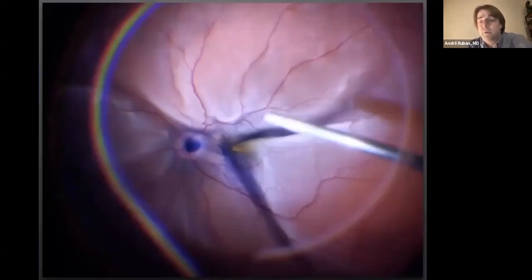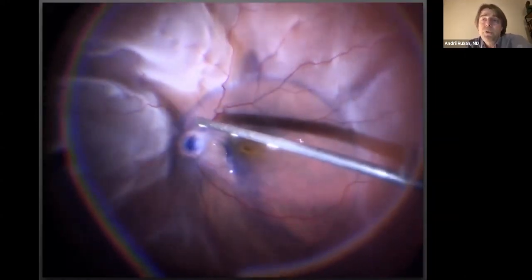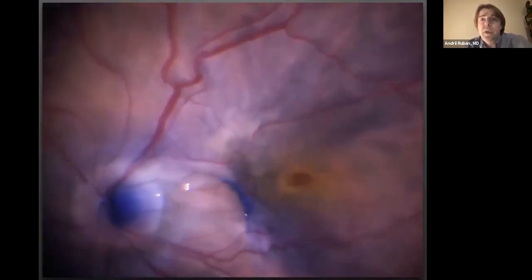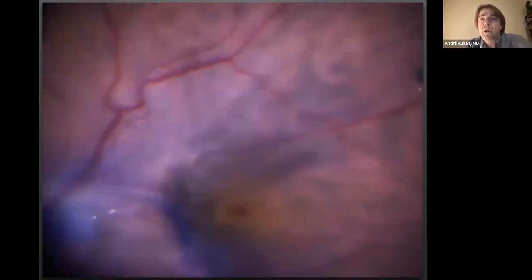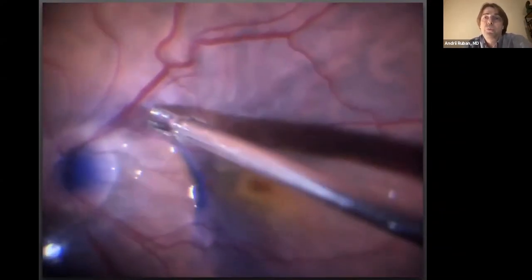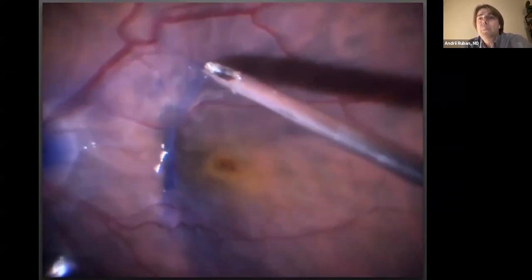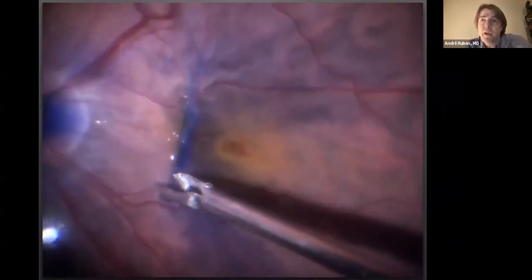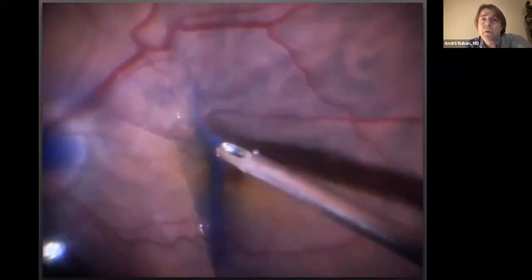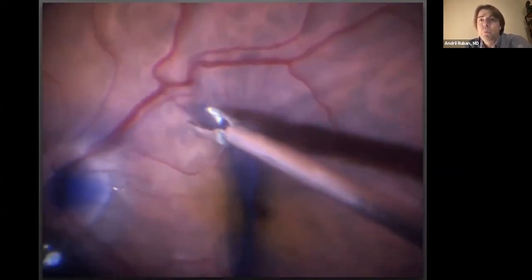In cases of retinal detachment with full thickness macular hole, I always remove epiretinal membrane and ILM. In this case, both epiretinal membrane and ILM are well visualized and their simultaneous removal was performed. The inverted ILM flap technique I only use in highly myopic eyes with longer axial length in such cases. And also I always drain subretinal fluid through the macular hole.